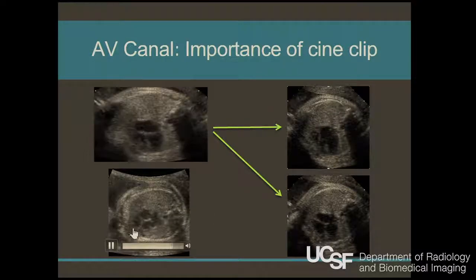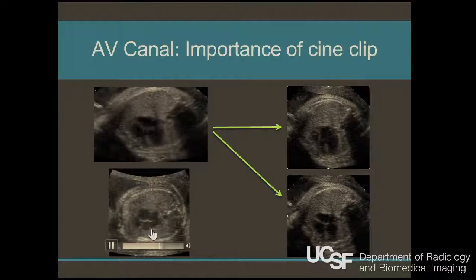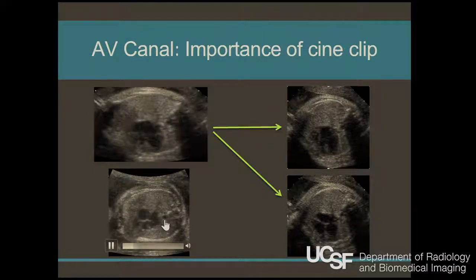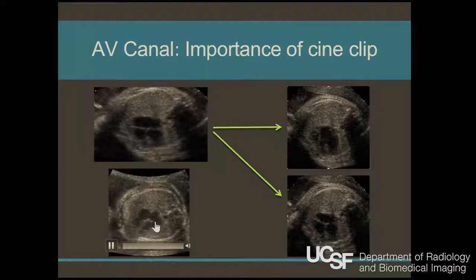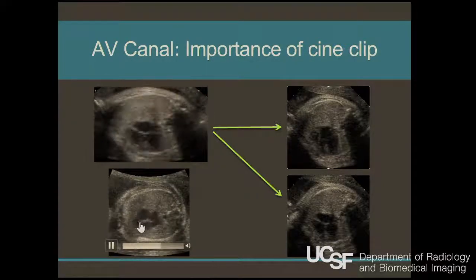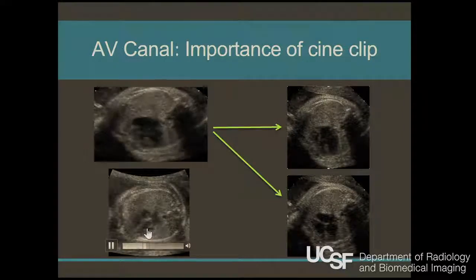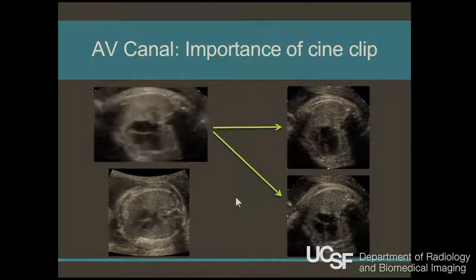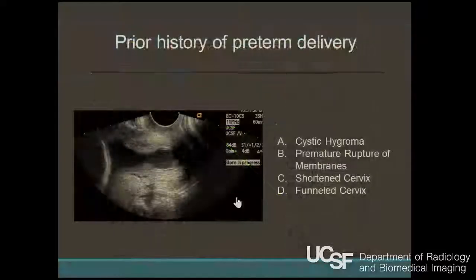So what I always do is look individually at the valves. Remember, if we identify the chambers, you've got your descending aorta, left atrium, left ventricle, right atrium. You want to look at both atrioventricular valves and make sure they're opening normally. Here you can see that it's just this giant monovalvular structure in the chest opening and closing. This is nothing too complicated, but a good thing to know about.